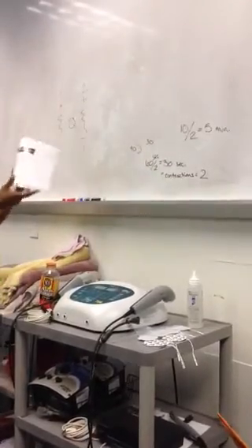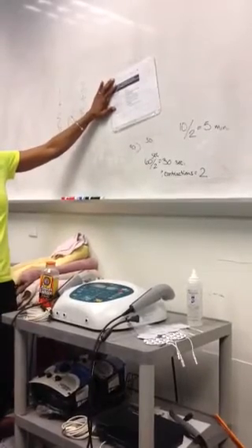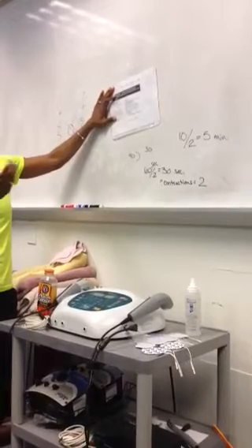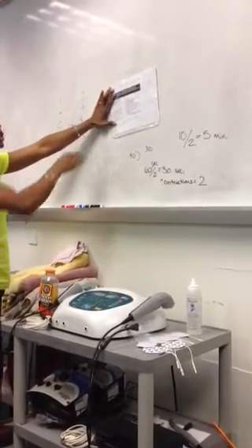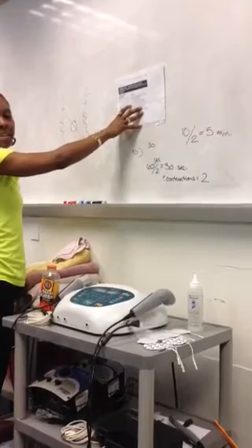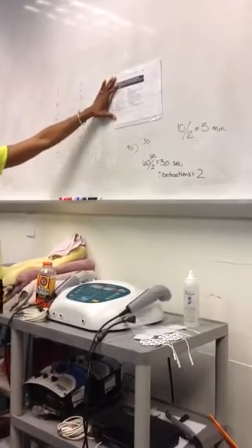And then on the other side, the other chart is easy. So remember our target temperatures? Okay, so we've got our non-thermal setting. I'm not really going to give you a non-thermal on the practical, okay, but you all should know how to use it, because it's in your notes and we went over it then. But you have 1 degree Celsius, that's our mild setting. Our moderate setting is 2 to 3 degrees Celsius, and then our vigorous setting is 3 to 4 degrees Celsius, okay?